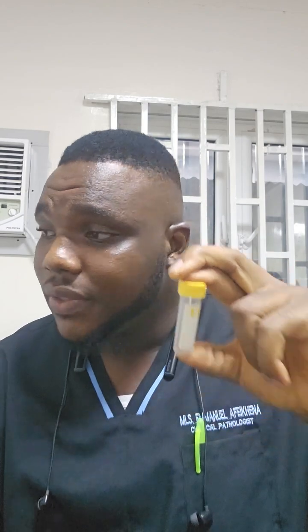So, like I said earlier, this sample container can be used for glucose estimation. I have just explained how the anticoagulant and the anti-glycolytic agent in this container work and why we use it for glucose estimation. Now, this is also a lithium heparin container, but I will be using it to explain the sodium citrate container.